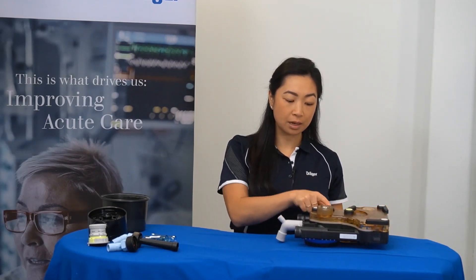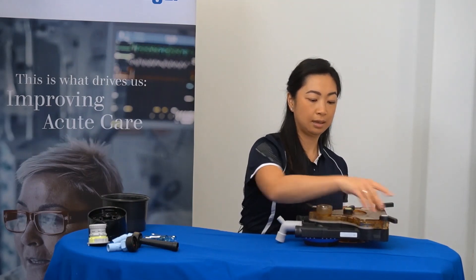The cover of the breathing block can be removed by opening up the three grey levers and lifting off.